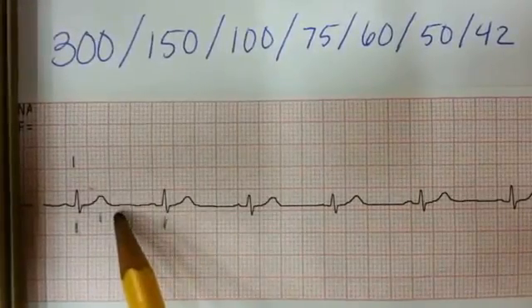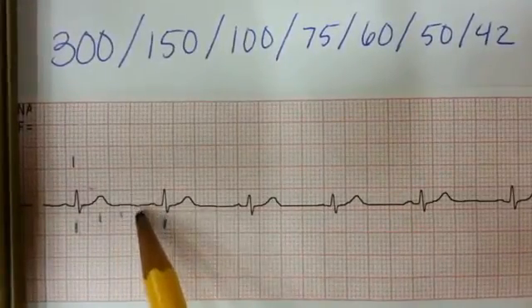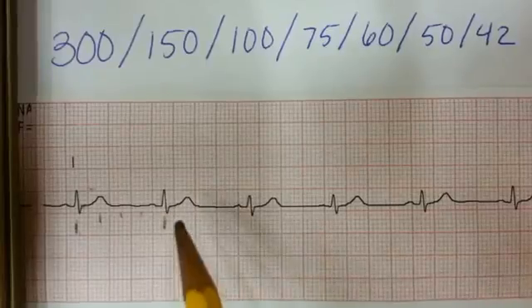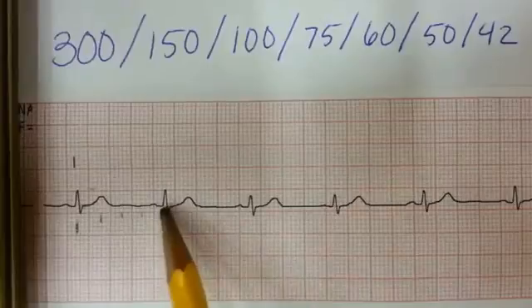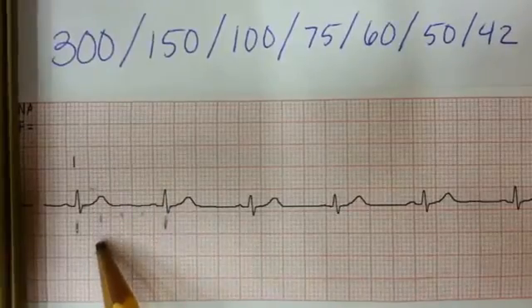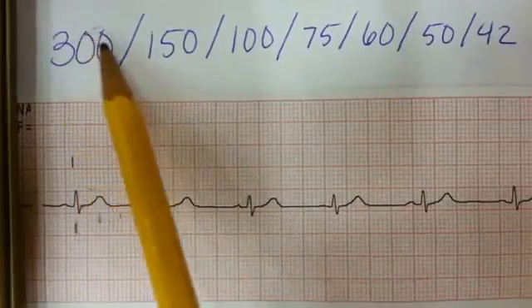There's mark one, mark two, mark three, and then finally I already marked mark four. So that means that if the QRS complex fell right here, we'd know that the heart rate would be 300 beats per minute.